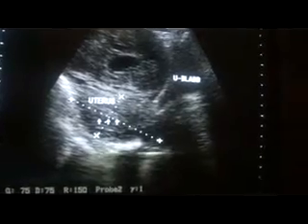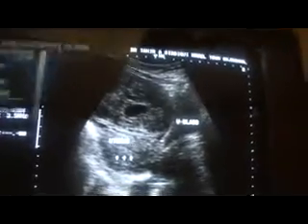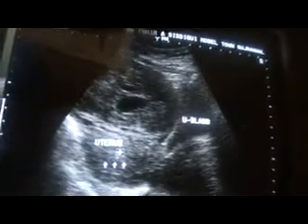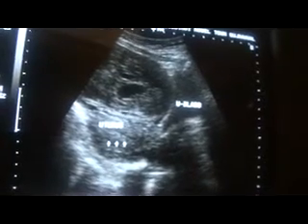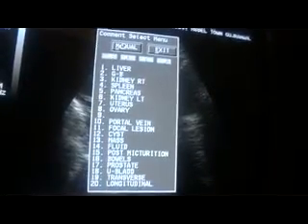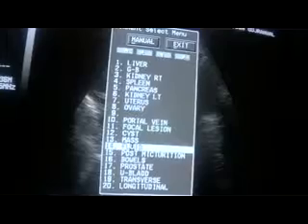This is the urinary bladder. This is the cystic area, which measures approximately 2.9 centimeters by 3.4 centimeters. And as I move anteriorly, I see a sac-shaped structure with fluid collection, and this fluid collection is seen extending into both iliac gutters.